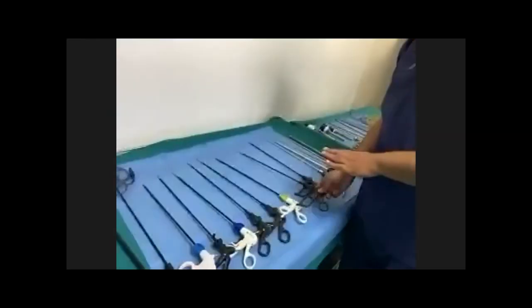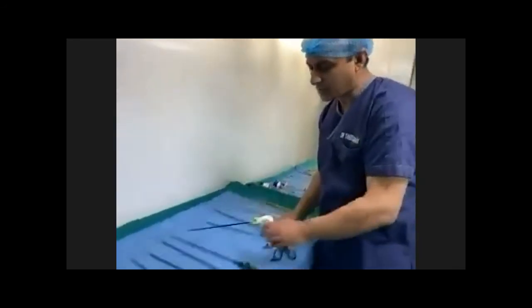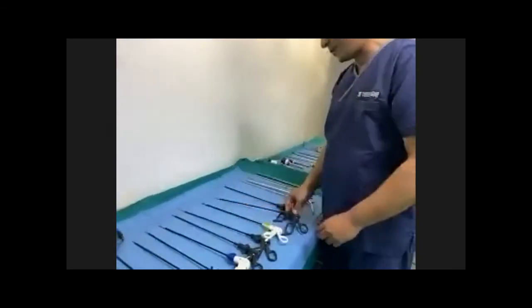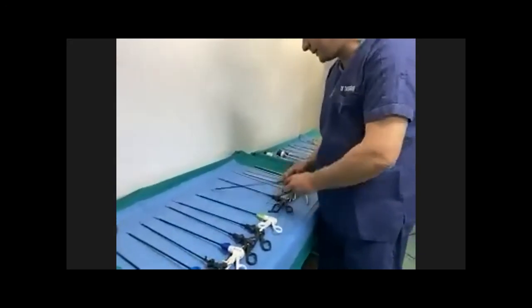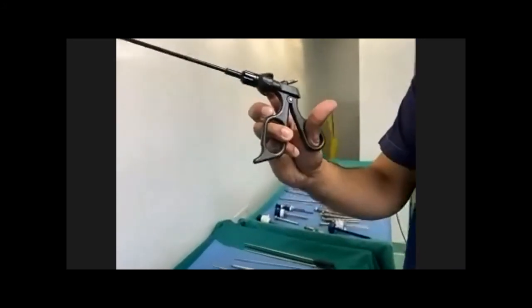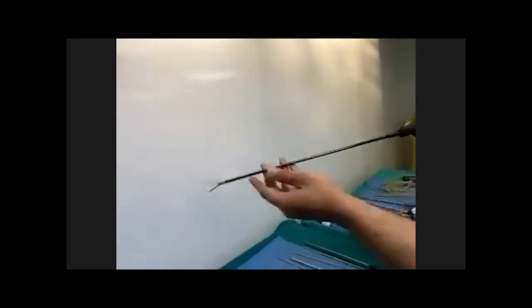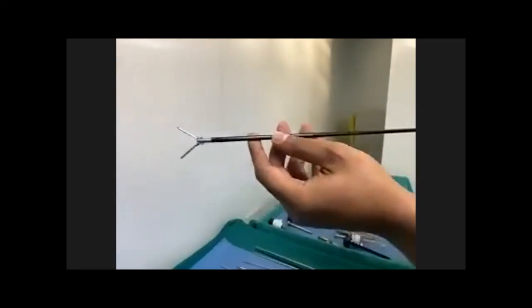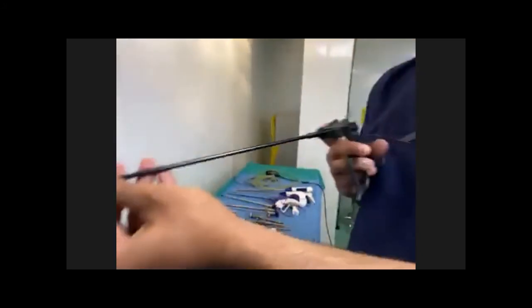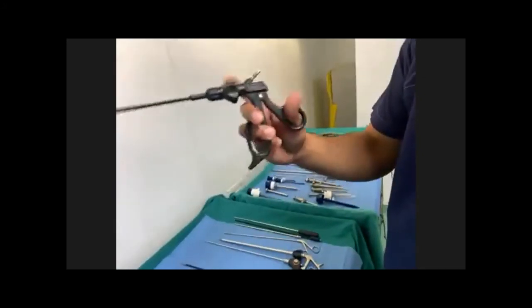In laparoscopic instruments, there are reusable instruments which you can sterilize, and at the same time disposable instruments which you can use in a case and just throw away. Here you can see this is a grasper, which is a double action grasper, and it is an atraumatic grasper, right? And it has no lock over it. I'll show you the lock or the ratchet, what it is and what it is used for. So you can easily hold the bowel during an appendectomy or any other intra-abdominal procedure during laparoscopy. It also has the area to be attached with the cautery, and there is a handle and a knob to rotate it.